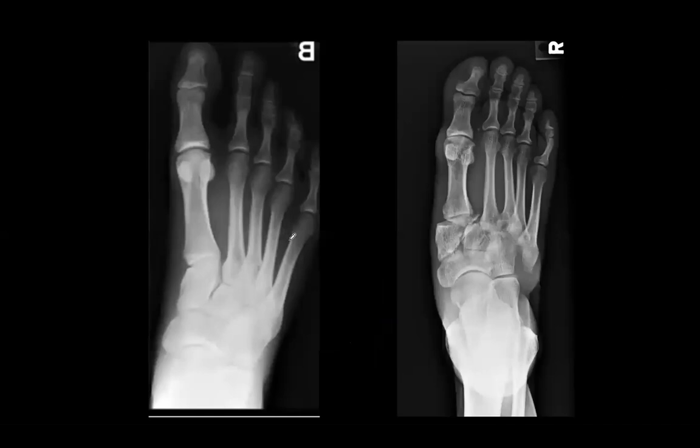Okay, when we look at an AP view of the foot, some things that aren't necessarily angles, but overall general alignment things, is we look at what's abnormal here for this Lisfranc injury on the right. Just increased clear space between the medial cuneiform and base of the second met. Or it's not aligned. Oh, on the right AP view, it's shifted. Good. You can see the lateral step off here, right? So you look at the second met base and middle cuneiform, and then if you had an oblique, we would look at the fourth met base and cuboid. So those are important things to identify.